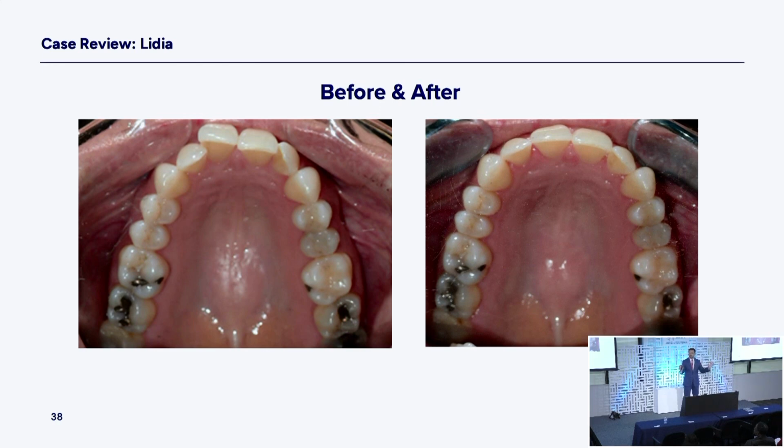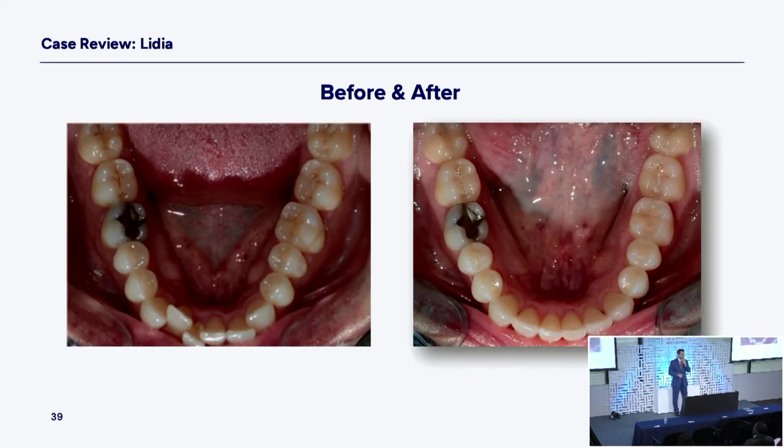You haven't had to do any IPR. You have a beautiful arch form. You know how that's going to present in her smile? It's going to look good. When 7 to 10 gets spread out, it's going to look very nice because she's collapsed and narrow, and she's showing you 8 and 9 predominantly. We want to see all those front teeth, canine to canine. So now we've got this change 1 year later. The lower is going to follow that. Now by now you probably noticed she happens to have 32 teeth.